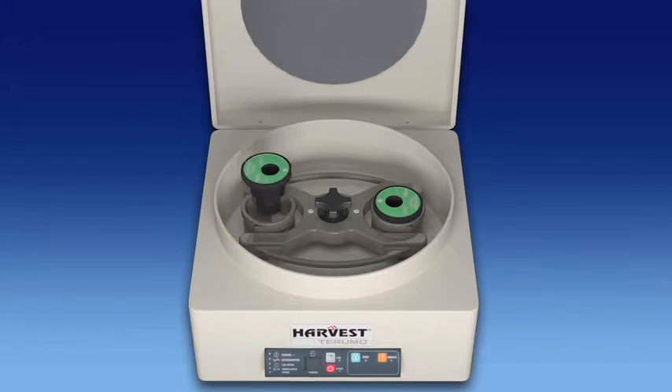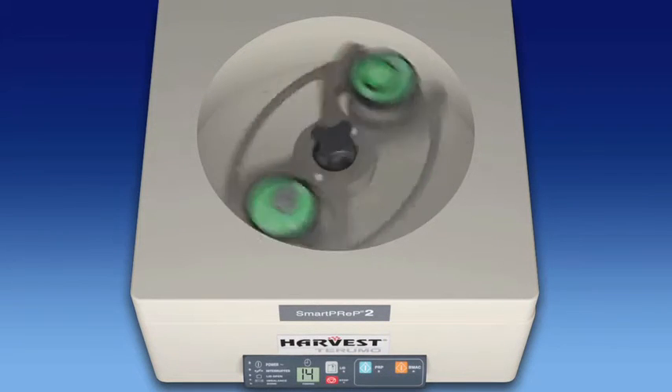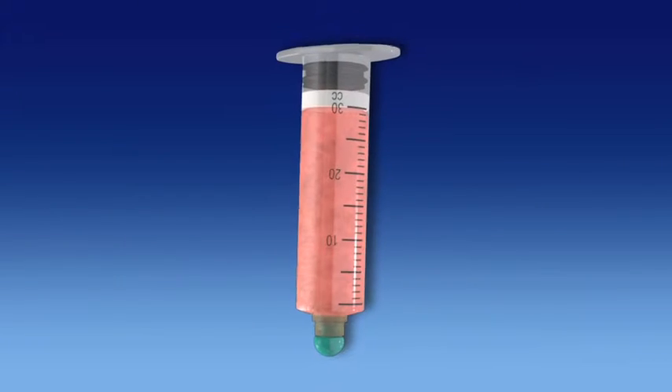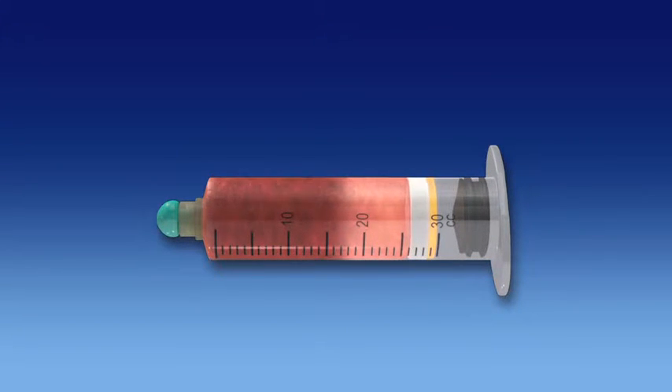After lipoaspirate addition, the processing disposable is loaded into the SmartPrep centrifuge for a brief 4-minute centrifugation. During processing, the lipoaspirate is separated into three distinct fractions based on their individual specific gravities.